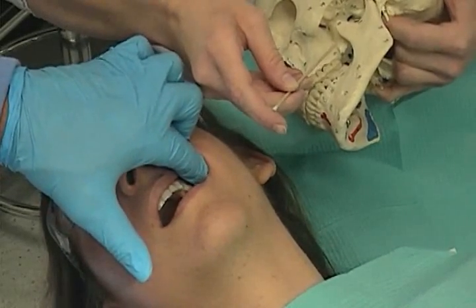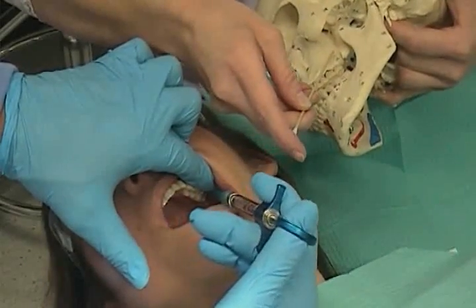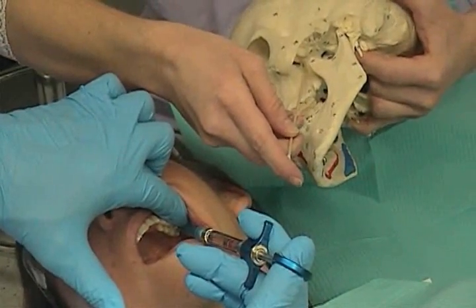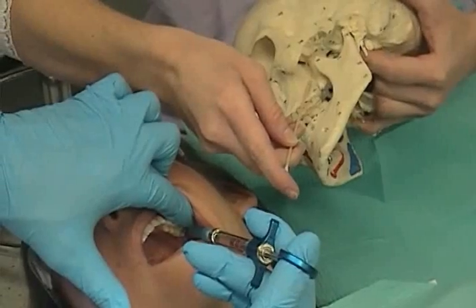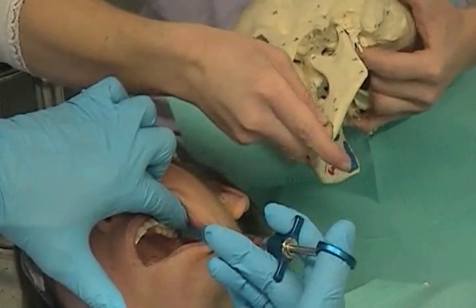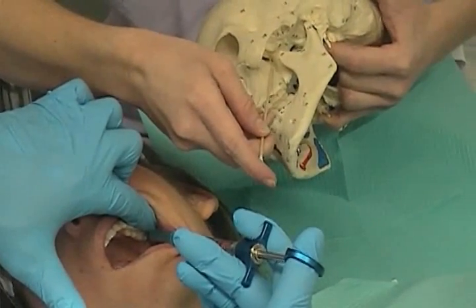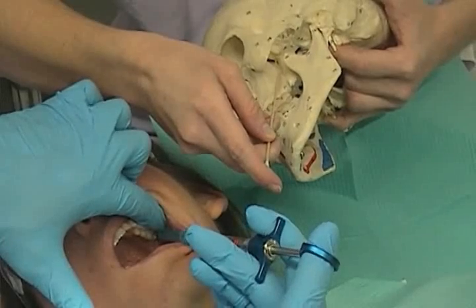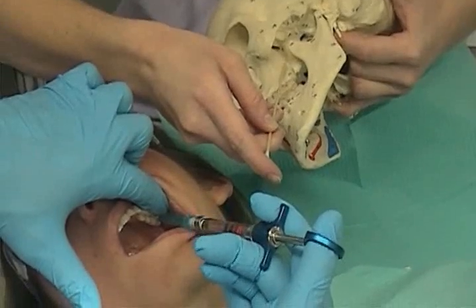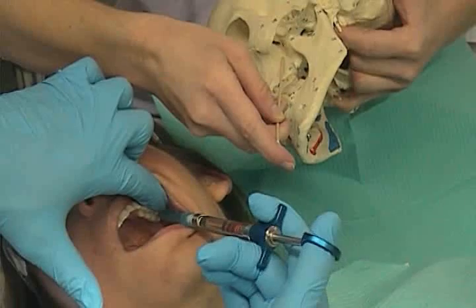Once you've done this, the basic idea here is to have a three-direction approach in one movement. In other words, we want to go up, back, and in, all in one motion. The book indicates 45 degrees in one plane and 45 in another. If you approach the target site with this in mind, you will have incorporated those three directions — up, back, and in — all in one motion, like so.